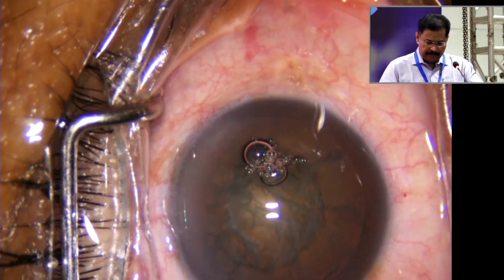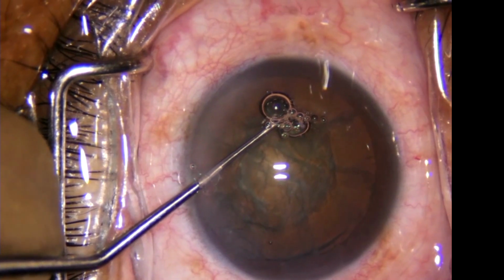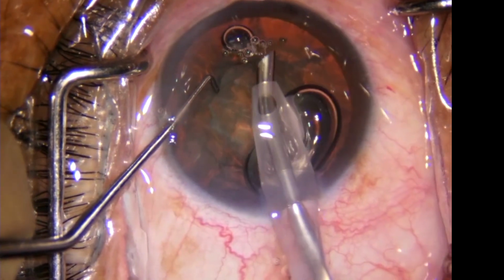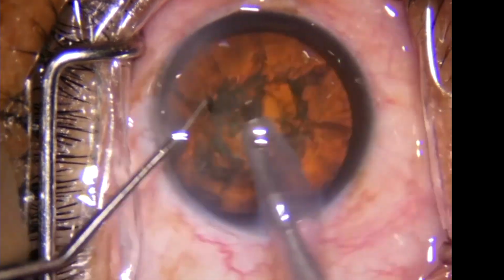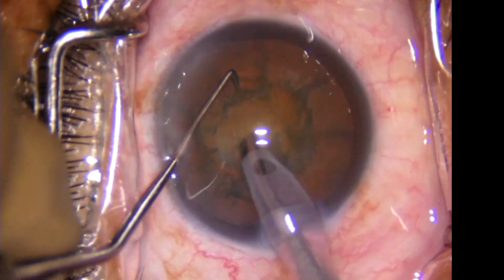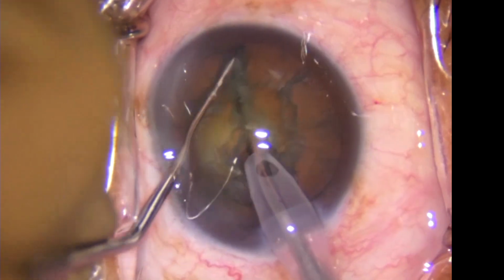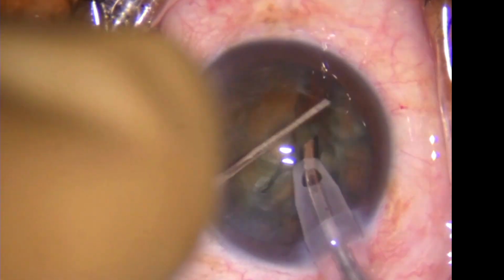So here again, hydrodissection has been done. This is my blunt chopper. Nothing big about it. It's just a straight thing with the tip blunt. So initially remove all the cortex and the epinucleus. Then you'll see the center nucleus well. Then you'll know how deep to go. Otherwise you'll get a wrong idea that you have gone deep enough, because if you leave a lot of cortex on top. So now a small trench. See, going to the periphery, keeping the chopper tip there, and support from this side.